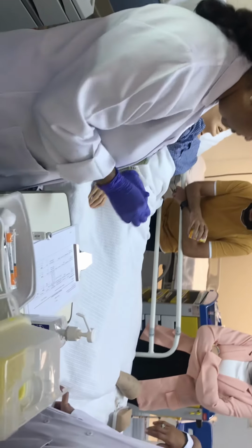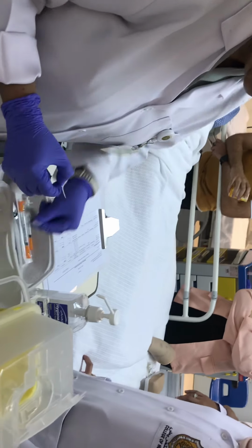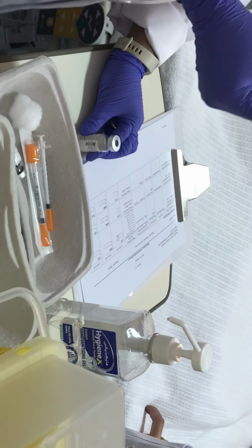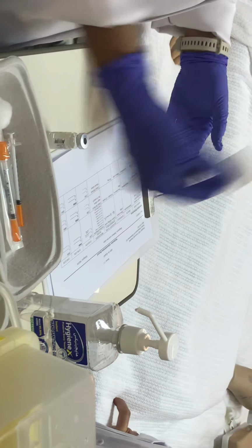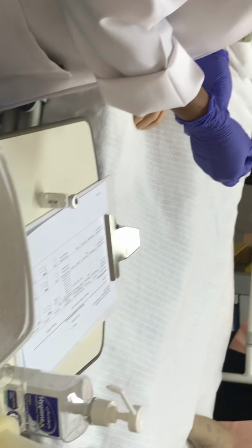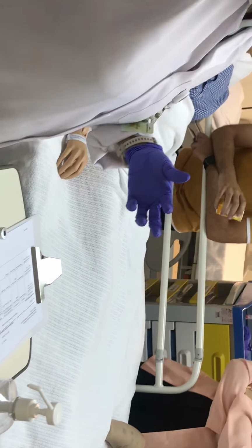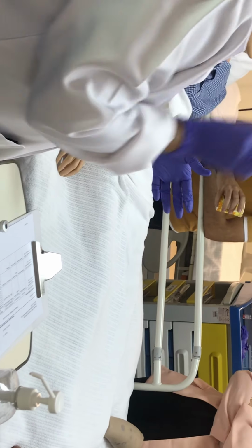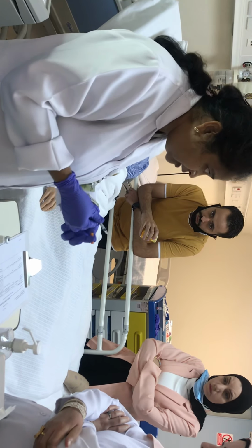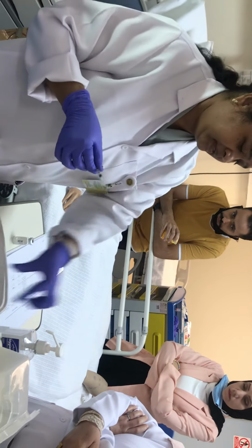Now why did I take 2? Because I want to clean my vial also. If there is 1, clean it like this nicely from center to outside. If you have 2, just turn it the other side and use it. No need to waste 1 more. And 10 units. Now once they remove the cap, they can never recap. Please instill in their mind, no recapping, because that is the policy of our hospital. And also needle stick injuries are avoided. When you saw me opening, no struggling to open like this, just pull it out like that. That is the best method.